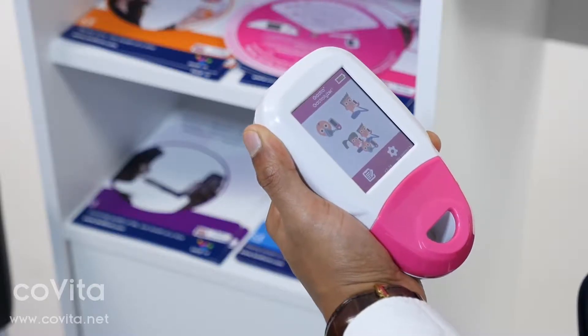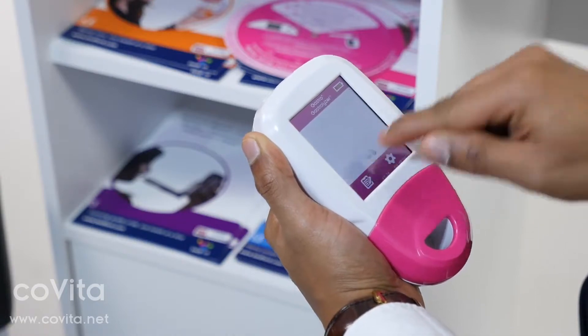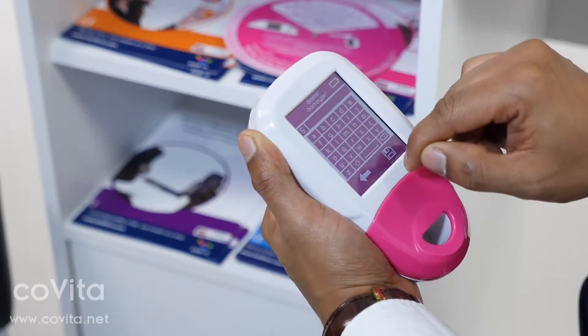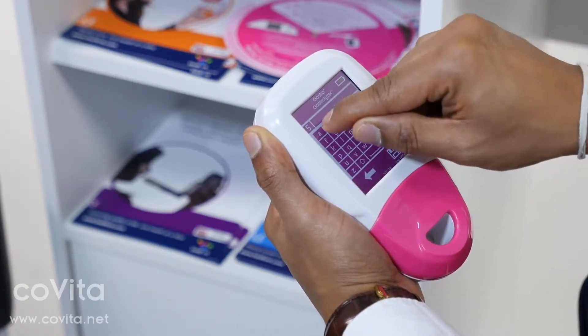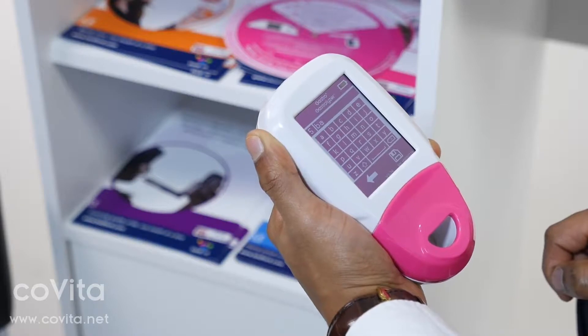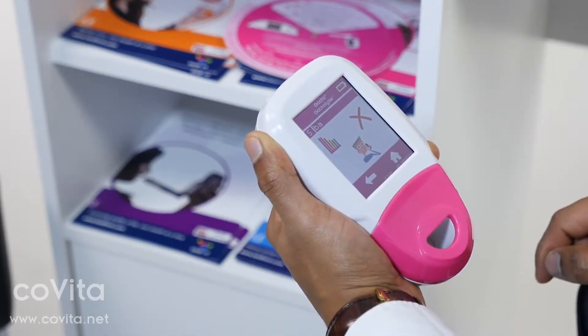The Gastro Plus Gastrolyzer can store up to 10 patients on the device. To add a patient, first click on Register, then click on a blank slot, which will take you to a new profile. Click on the blank slot again at the top of the screen and use the keypad to enter their name or patient ID. Once you have entered this, click the save icon to register the changes.